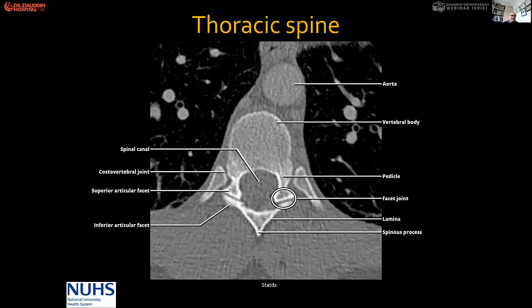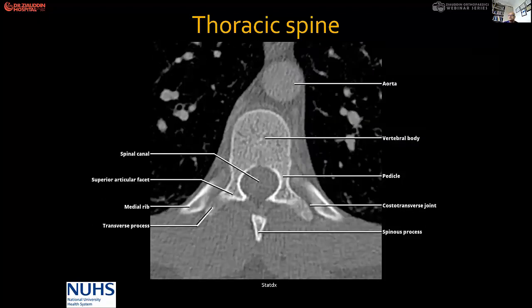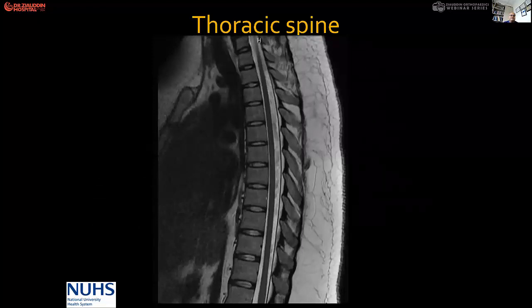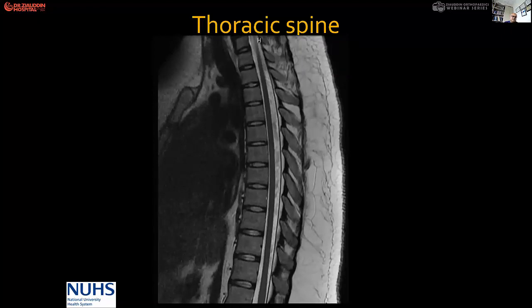This is the MRI of a thoracic spine. You can see vertebral bodies joined with the discs, the overhanging spinous processes, and the interspinous ligaments.